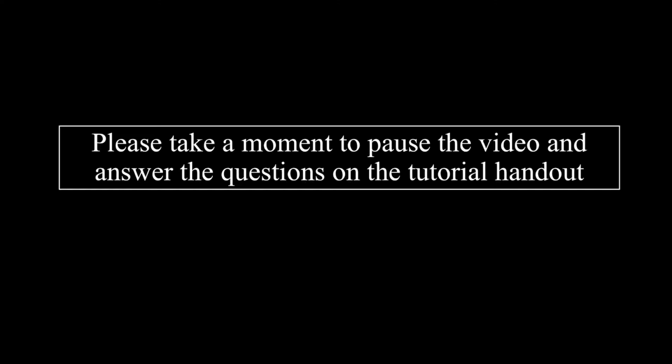Please take a moment to consider the following questions. Question 1. When would you use a more conservative correction method, such as Bonferroni? Question 2. How can we modify the threshold values on BrainVoyager? What impact do these modifications have on the results?